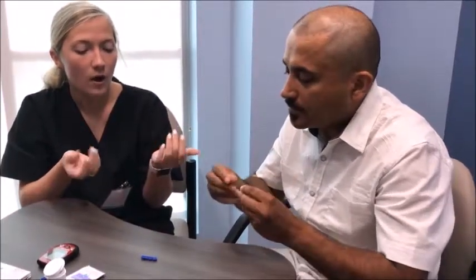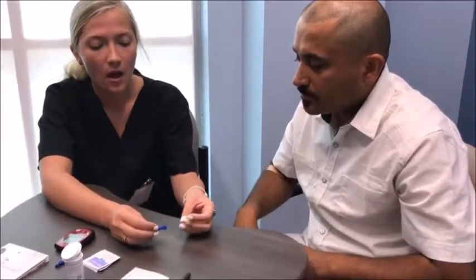But I would recommend rotating fingers, because one will get really sore if you keep sticking that one. Another tip is to go in at the side. Don't go straight on into your finger, go at the side. And if you know you have trouble getting blood, you can rub your hands or fingers together, or run them under warm water just to increase the blood flow there.